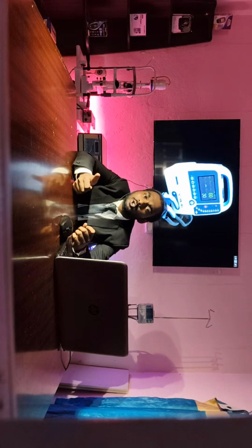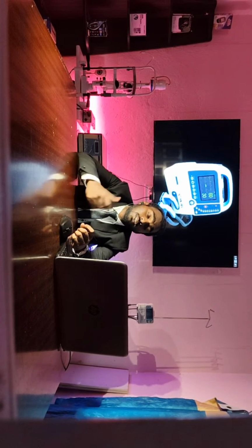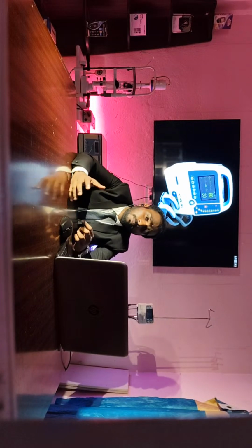Okay, so we take the paddle in the compartment and select the joules. What is the range? Say, 150 joules I am selecting. Then I give the charge. When I press the charge button, the energy is stored in the capacitors present inside the defibrillator. After that, it gives an indication that it has been charged. Then you can give a shock.